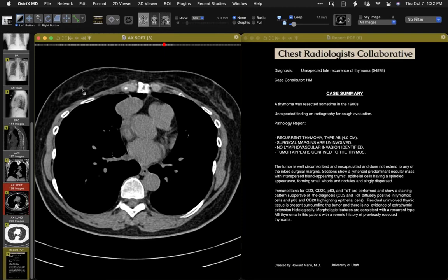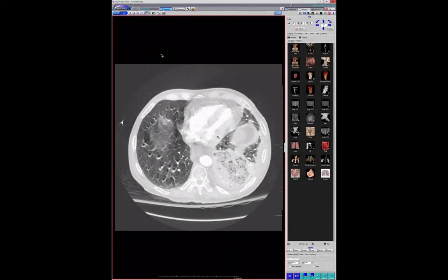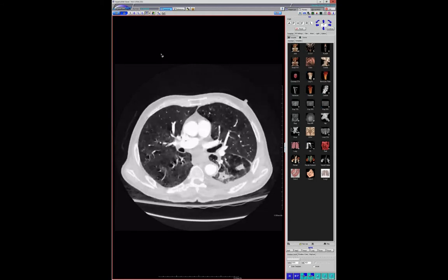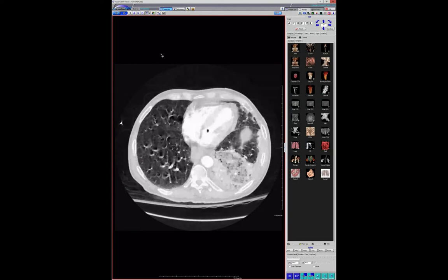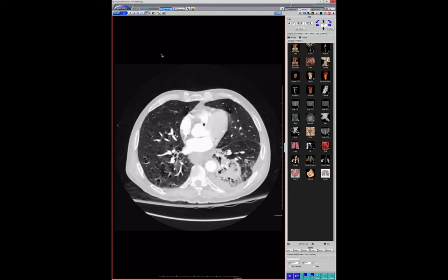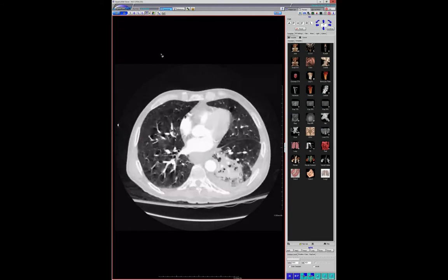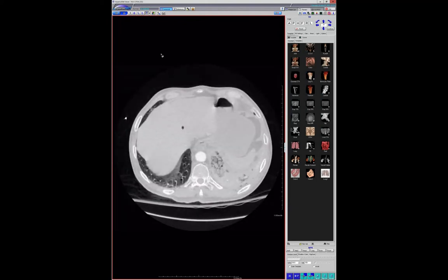So this is someone diabetic, immunocompromised, who has this big nasty goomba, which we thought was going to be mucor, and has a couple other nodules scattered around. But this was extensively biopsied, and this was all staph, and he subsequently developed staph bacteremia. I actually had another case this morning of more diffuse looking things, but that guy had staph septic arthritis with septic emboli.